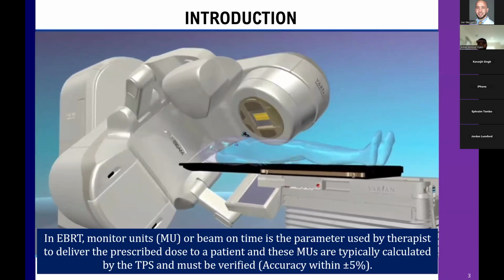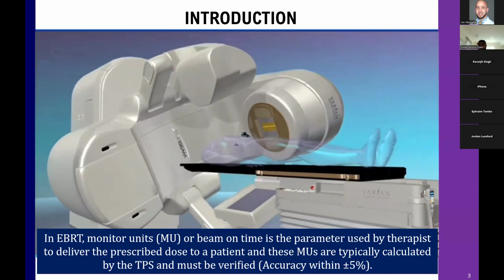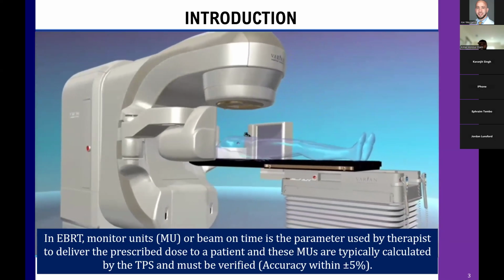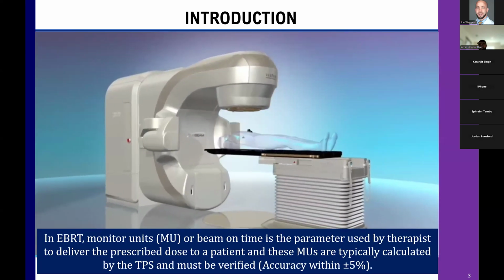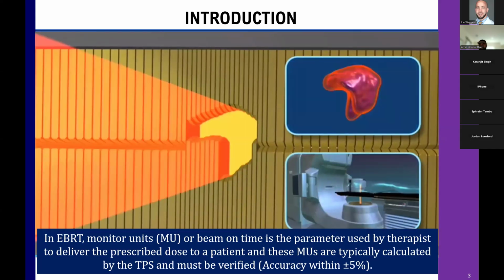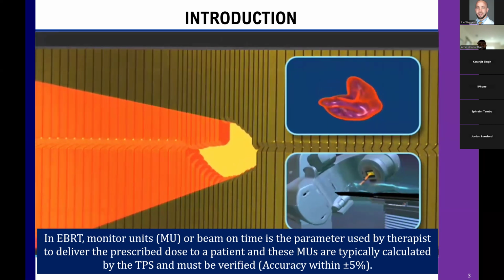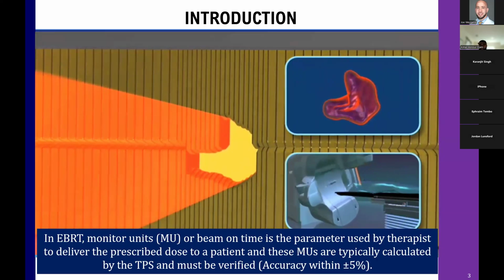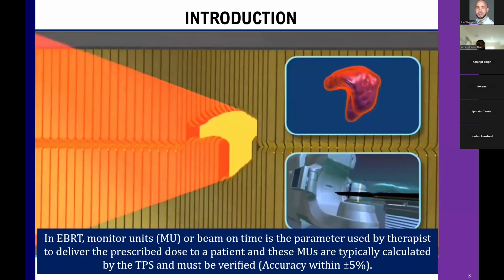What we know is that in radiotherapy, every fraction of radiation counts towards a patient's survival and well-being. What this means is that precision in delivering that radiation isn't just a technical goal, it is the difference between effective treatment and unnecessary complications. Therefore, we technically do not set the patient's dose directly at the console of a treatment unit. The physician prescribes a dose, and the therapist enters a certain number of MUs to deliver the prescribed amount of dose.